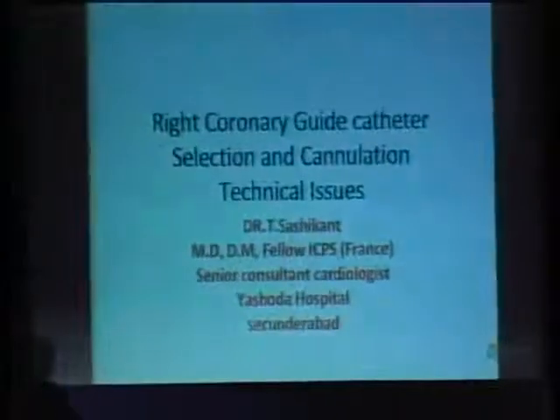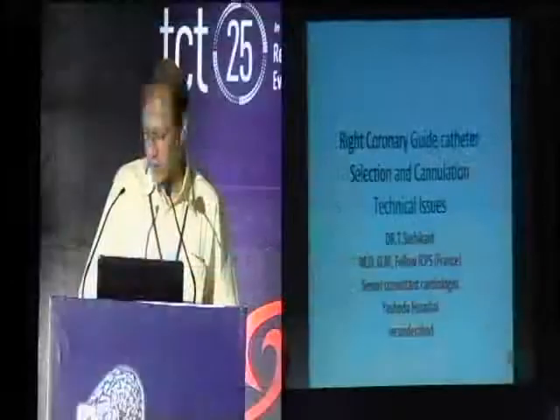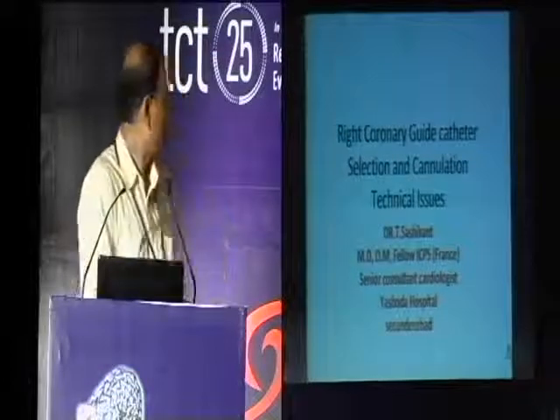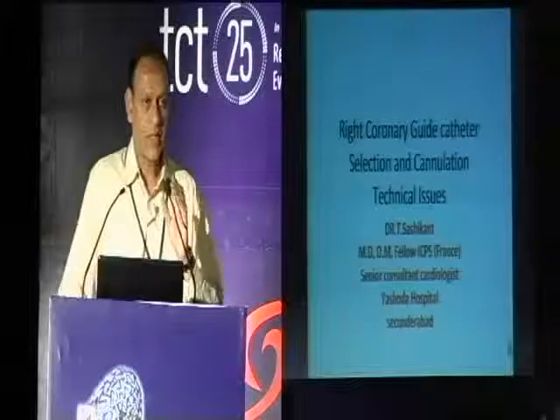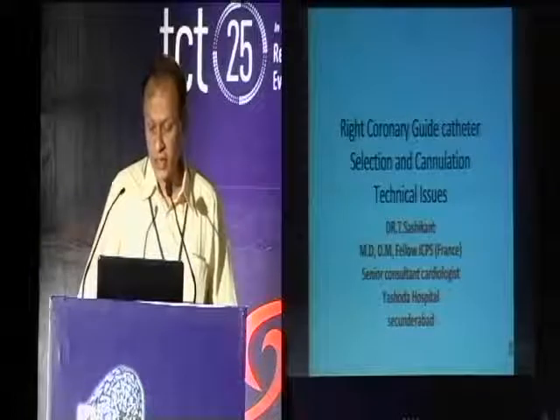So when you fail to intubate with a reused catheter, probably using a new catheter would make a lot of difference. So my topic today was right coronary artery guide catheter selection, the cannulation and technical issues.